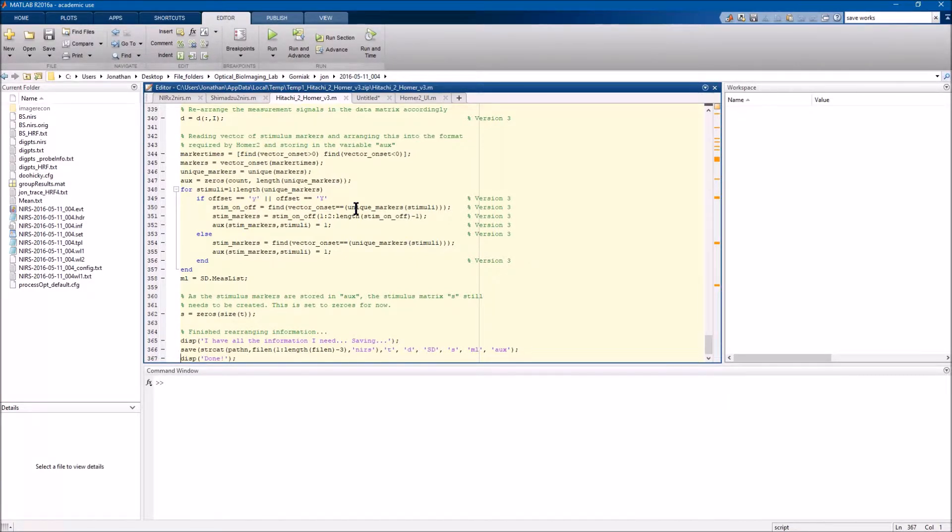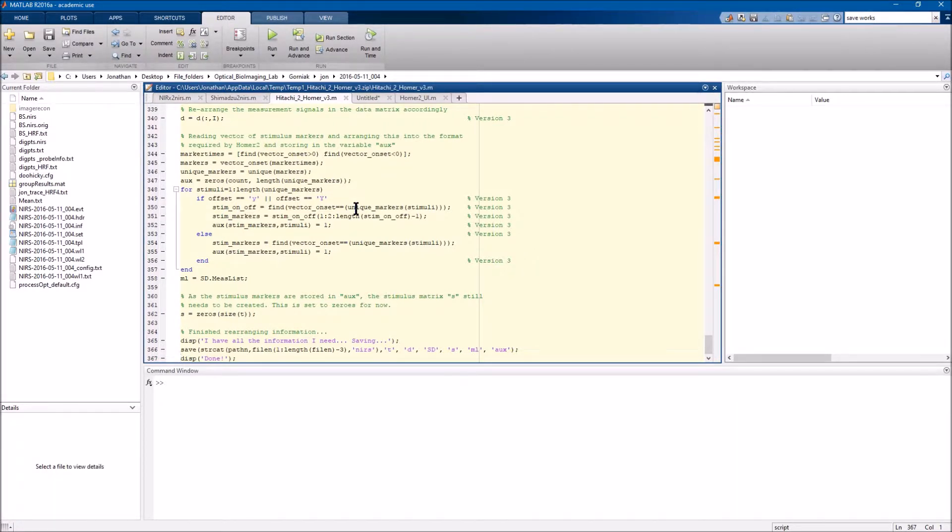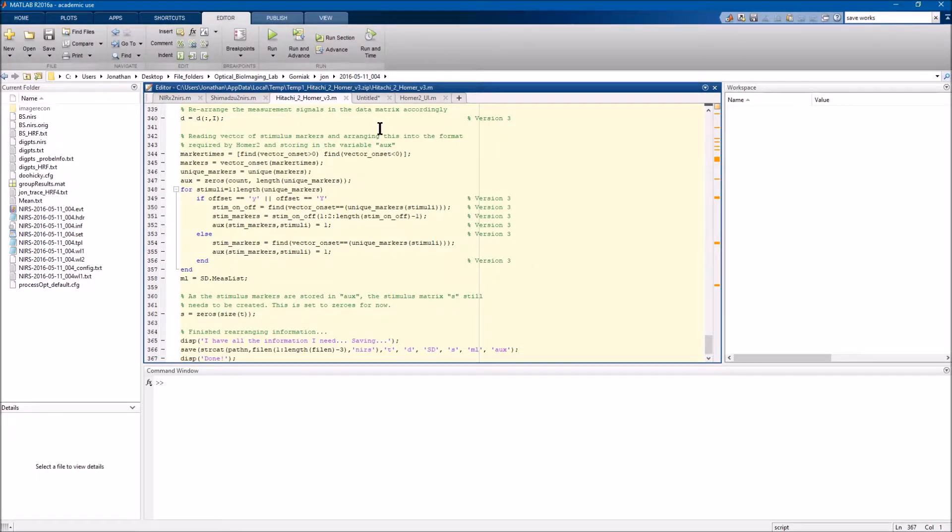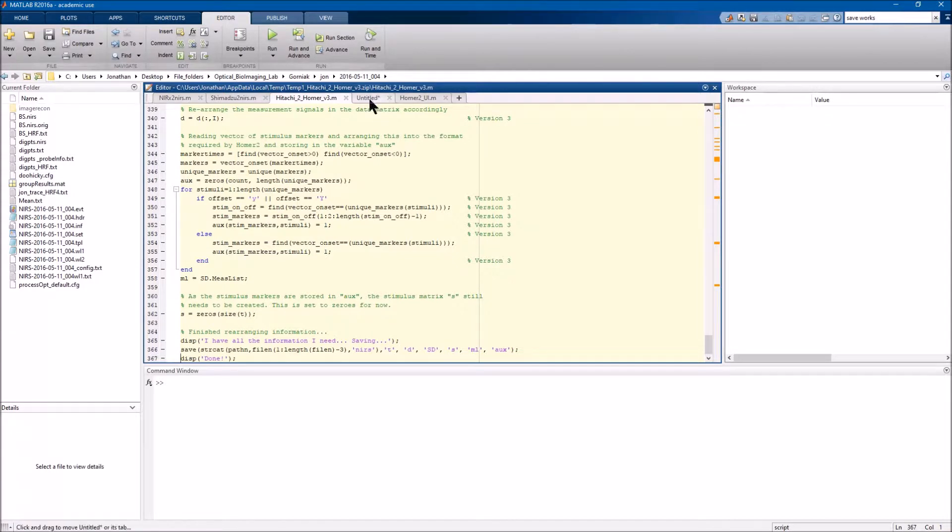What this will mean is that you more than likely will have to either add it after the fact or implement it into the conversion script before actually converting the data over. So the SD in SD struct just stands for source detector and the fact that it's a struct is just a MATLAB variable type.